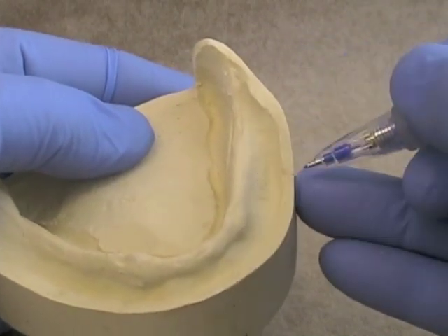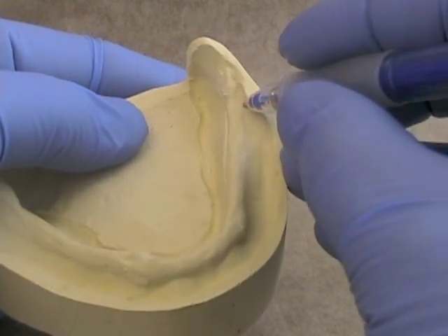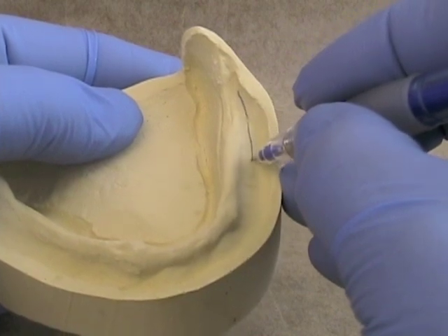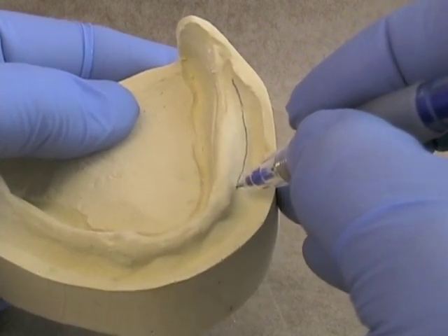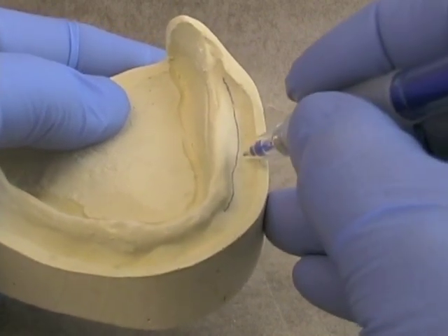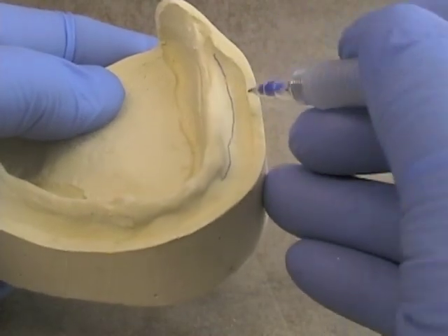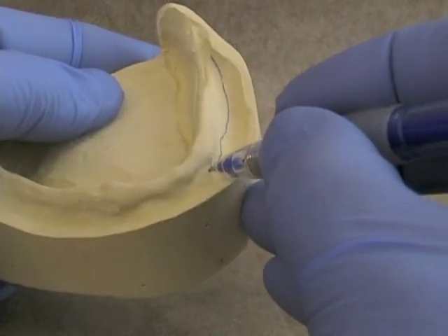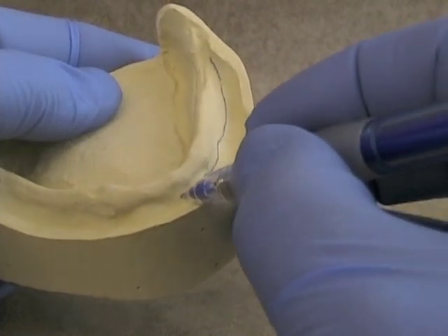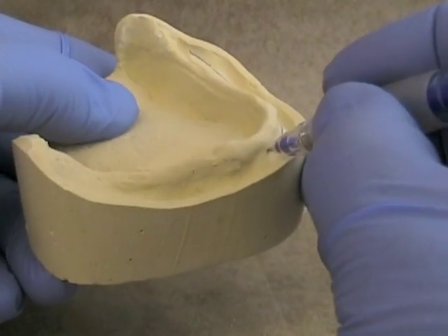Here we've got an extension that's quite a bit broader into the buccal vestibule. So we want to make sure that we don't extend too far. Again, we want to stay a little bit shy, and we want to stay on that vertical portion. We don't want our tray getting way out here into the vestibule per se, or into the cheek, or covering the external oblique ridge. So again, in this particular case, staying on the vertical portion, not much of a labial frenum on this particular case.